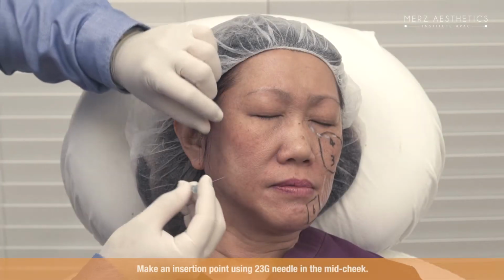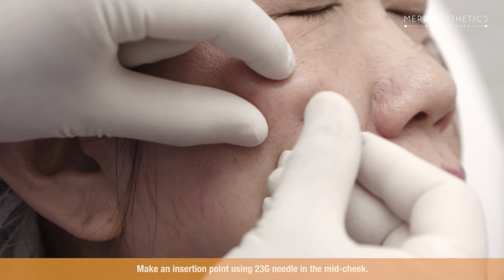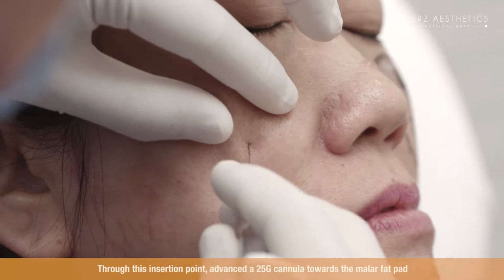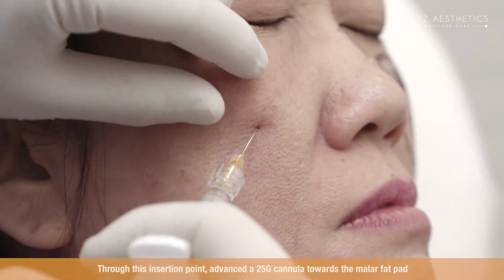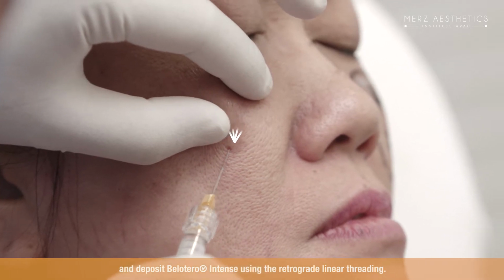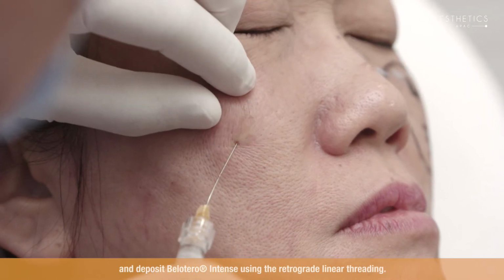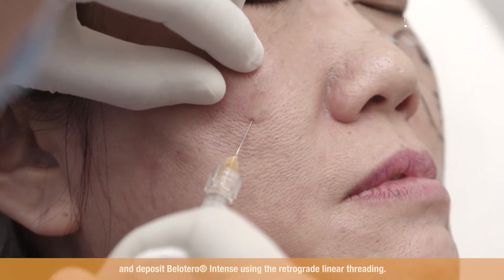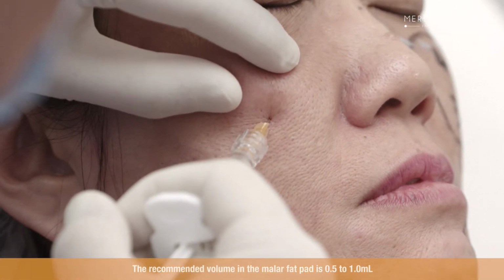The target area for the third injection point is the malar fat pad. Make an insertion point using a 23-gauge needle in the mid-cheek. From the insertion point, advance a 25-gauge cannula to the malar fat pad. This is the third injection area. Deliver Belotero Intense in the malar fat pad using the retrograde linear threading. Be careful not to traumatize the infraorbital vessels when injecting the filler. The recommended volume over here is 0.5 to 1.0 milliliter.